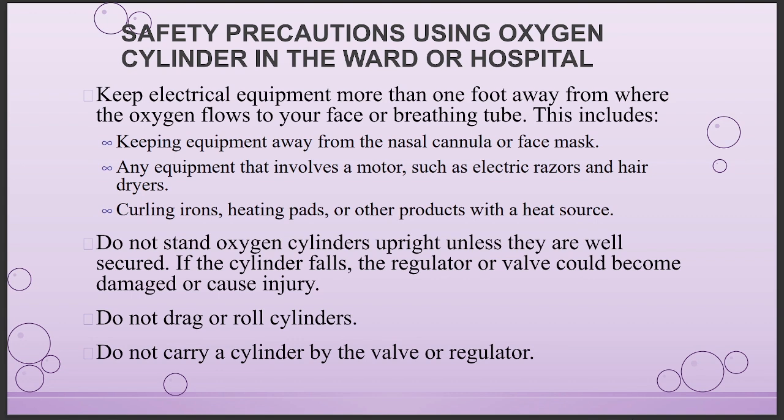What are some safety precautions to be kept in mind while using oxygen? Keep electrical equipment more than 1 foot away from where the oxygen flows to your face or breathing tube. Do not stand oxygen cylinders upright unless they are well secured. If the cylinder falls, the regulator or valve could become damaged or cause injury. Do not drag or roll cylinders. Do not carry a cylinder by the valve or regulator.